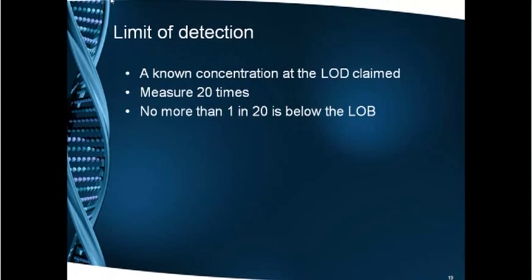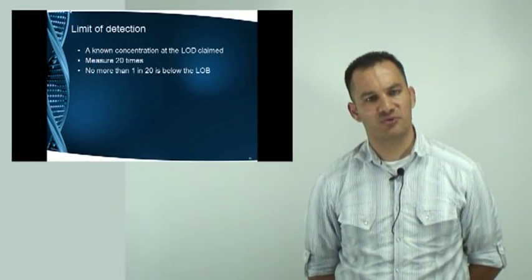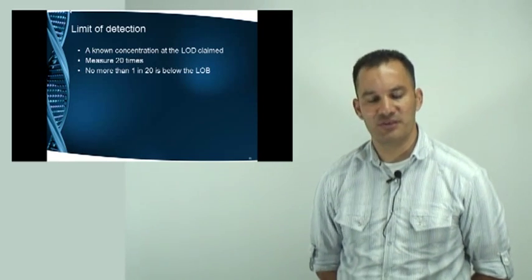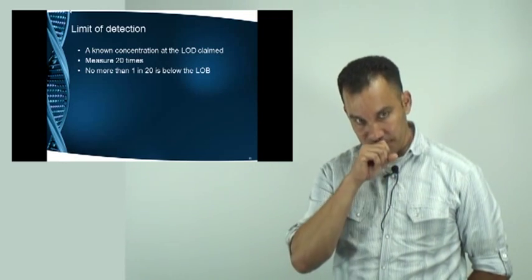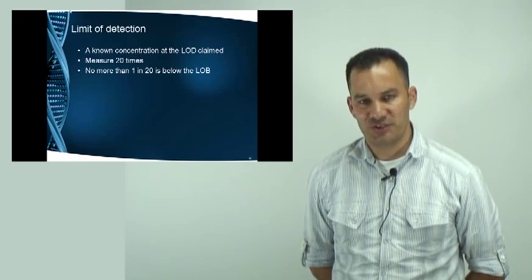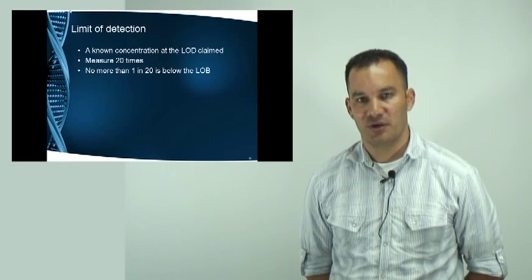The limit of detection is not something that we use, that we are not performing standards. It's something that we usually look at from the information provided by the manufacturer, and we usually take that information and put it into our validation report. We can do that, that's no problem, because usually you will have problems generating concentrations at the lower part of the reportable range.